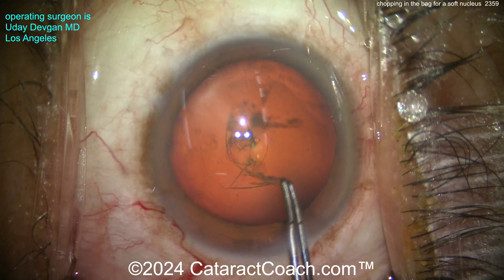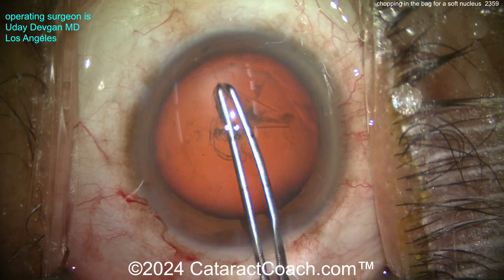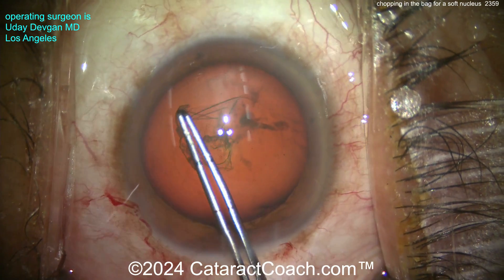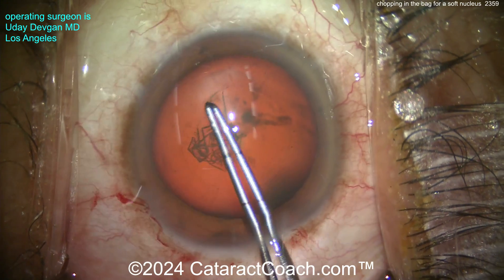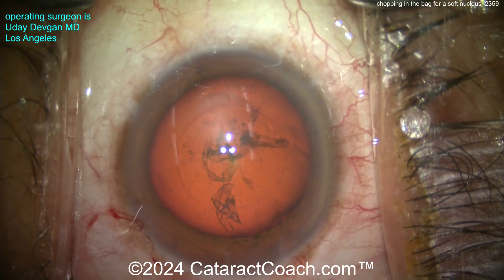Here comes the capsule forceps, the rhexis is going, and you can see we're going to tear a nice five-millimeter capsulorrhexis. To flip the nucleus out of the bag it's often easier with a slightly bigger rhexis — like five and a half millimeters — but this one is going to be just about five millimeters, nice and round, beautifully centered. We can measure at the end — yep, it's five millimeters.